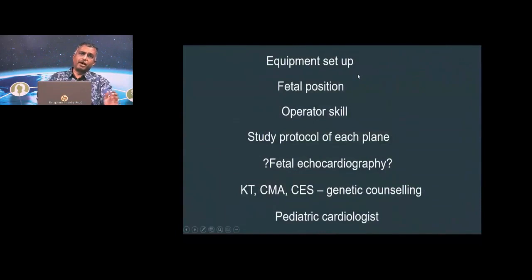So equipment setup is very important, fetal position extremely important, and this can be oftentimes trying. You have to wait until you get what you want. And remember, parents are willing to come for days on end to get their baby's heart checked, right? Operator skill is extremely important. Knowing what planes are to be produced is step one. Producing those planes is step two. The most important thing is running your checklist in each of these planes. If you begin to do that, fetal cardiology becomes mathematics, and your pickup becomes manifold.